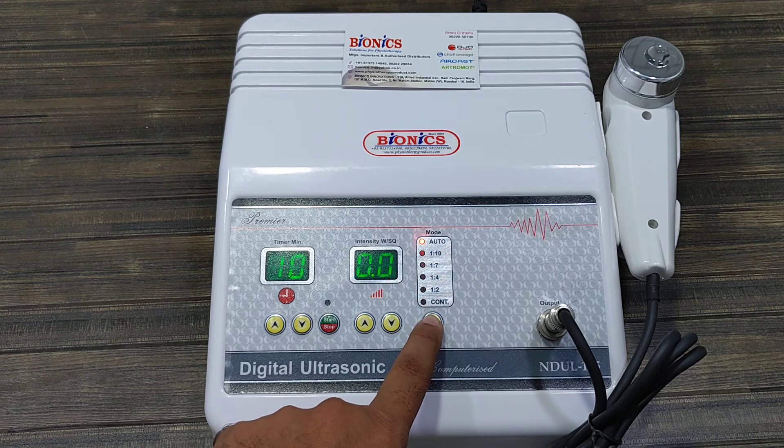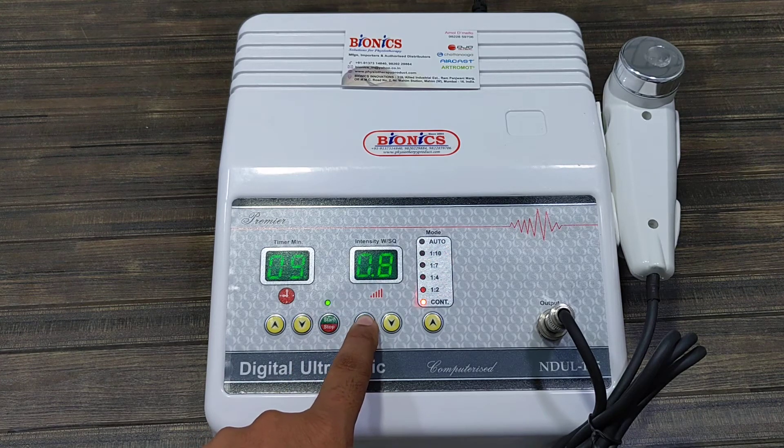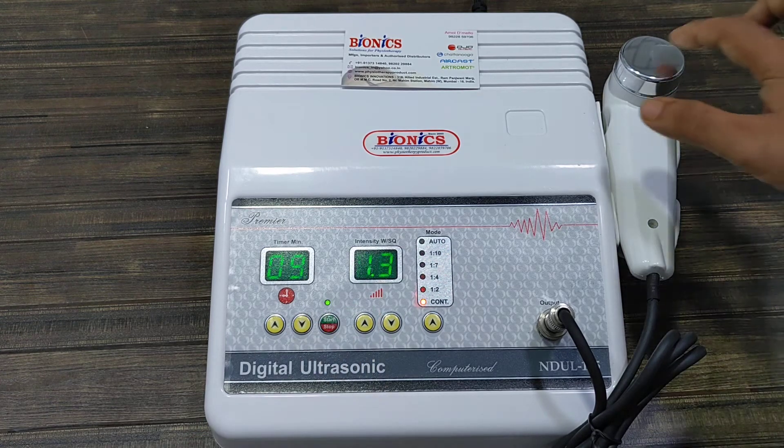The available modes are: continuous, auto, 1 is to 10, 1 is to 7, 1 is to 4, and 1 is to 2, and continuous. Just press the start button and increase the intensity — you can see the output.